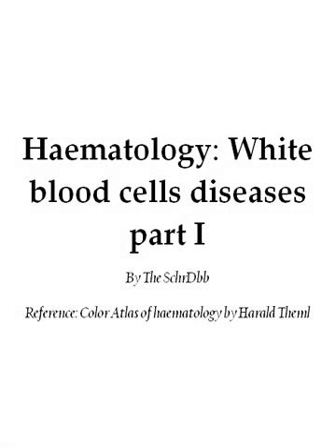Hello, this is white blood cell diseases part 1, with reference to the Color Atlas of Hematology by Harald Theml. So here we're going to visualize abnormalities of the white blood cell series.